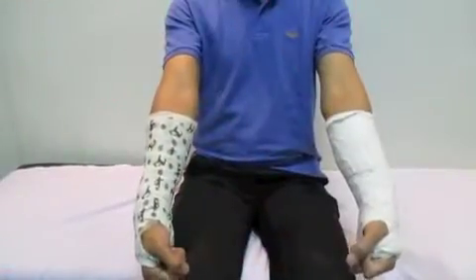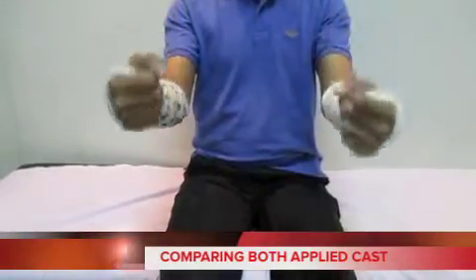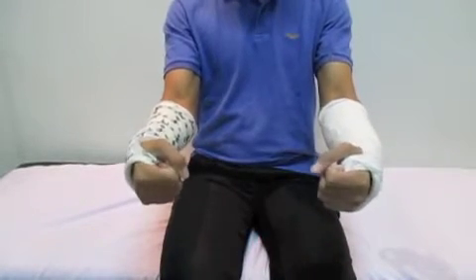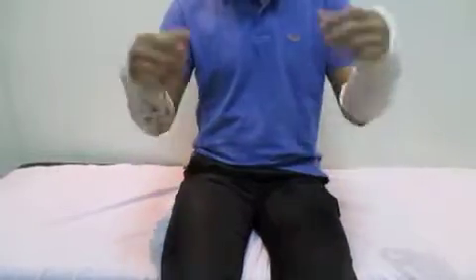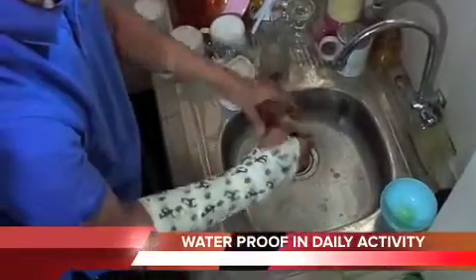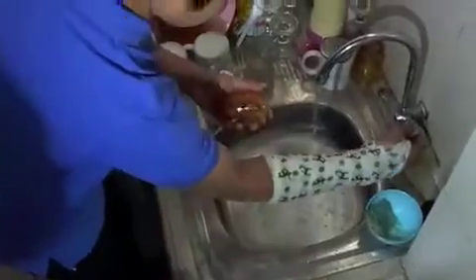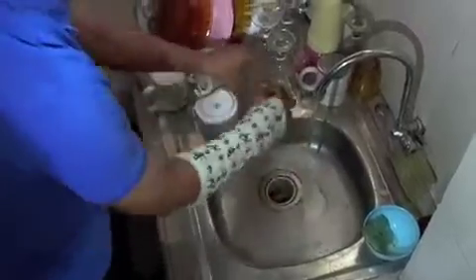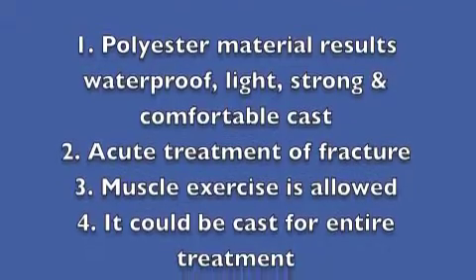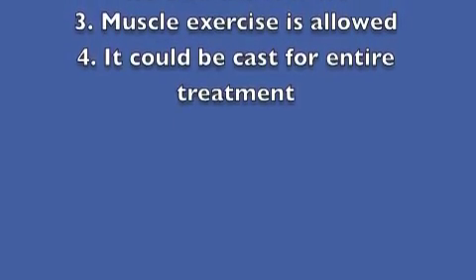Using focused rigidity cast, patients can do more movement and feel comfortable doing muscle exercises. Most importantly, the polyester cast is lighter than classical POP cast. By using focused rigidity cast and polyester synthetic materials, patients are allowed to do daily activities without worry. In conclusion, the focused rigidity cast using polyester synthetic and synthetic orthopedic padding will give a lot of advantages not only for the patients but also for the doctors.